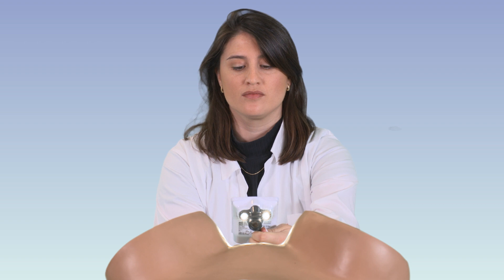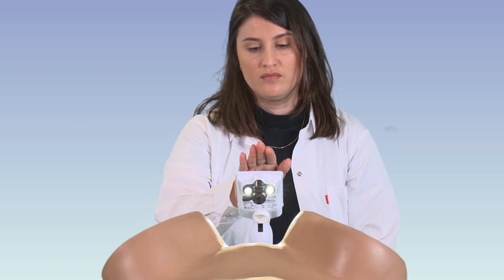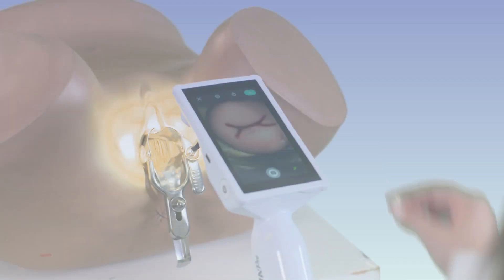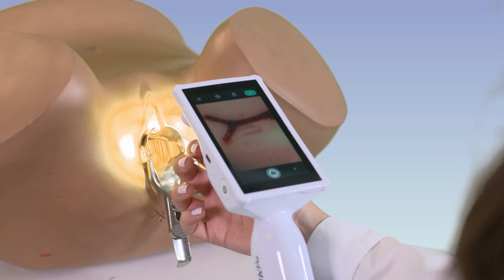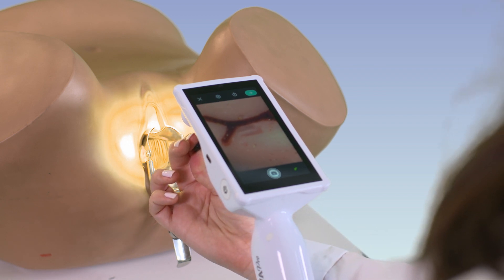Gently adjust the focus knob to achieve optimal focus. Use a hand wave motion to take your perfect cervix image. If necessary, slightly pinch the image on the screen for further in-depth view of the cervix and adjust the focus accordingly.